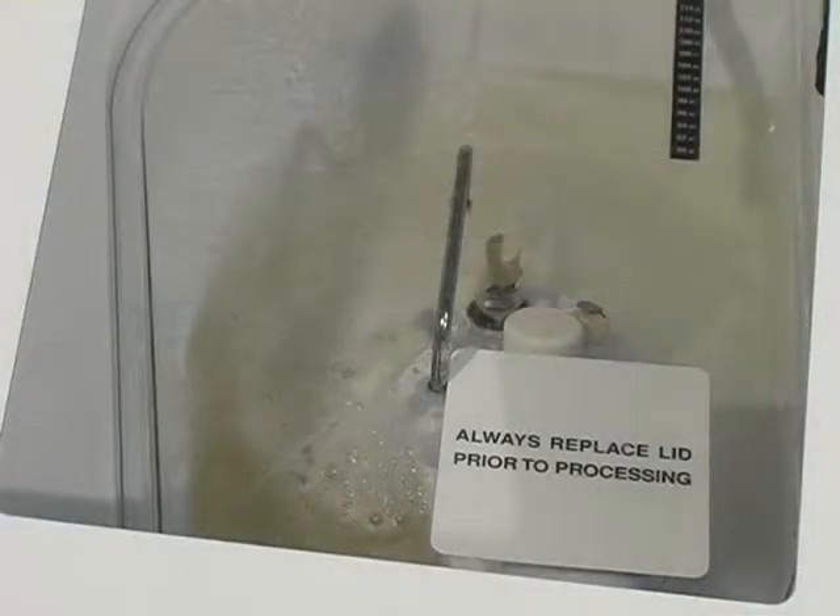Medivators has data on file to show that, with proper air flow and air handling systems, glutaraldehyde-based products, including Rapicide, can be used in Medivators reprocessors safely and below the maximum exposure limit of 0.05 parts per million. The basin cover, which floats on top of the disinfectant solution in the basin, offers additional vapor suppression.